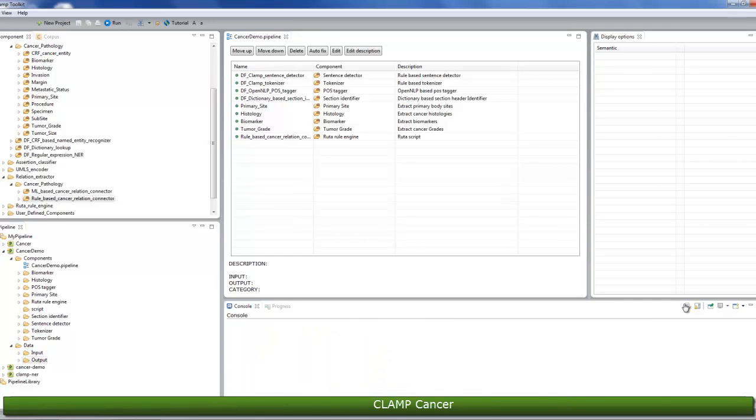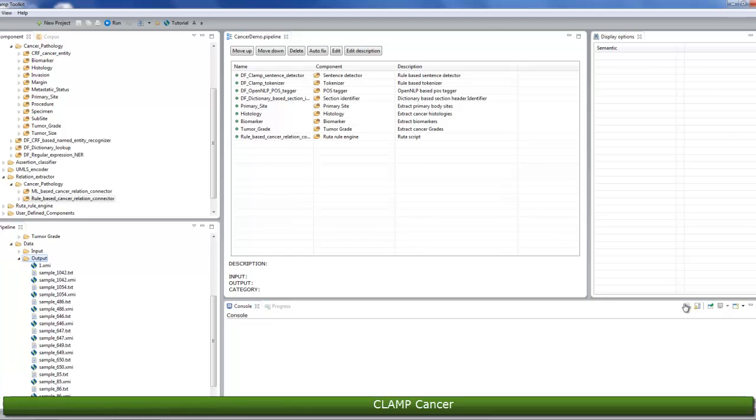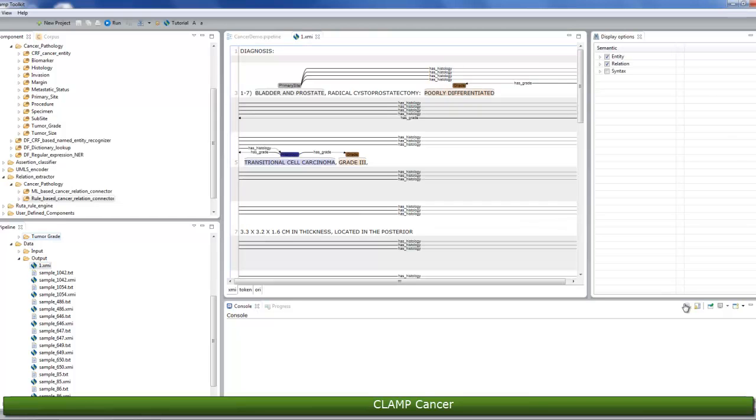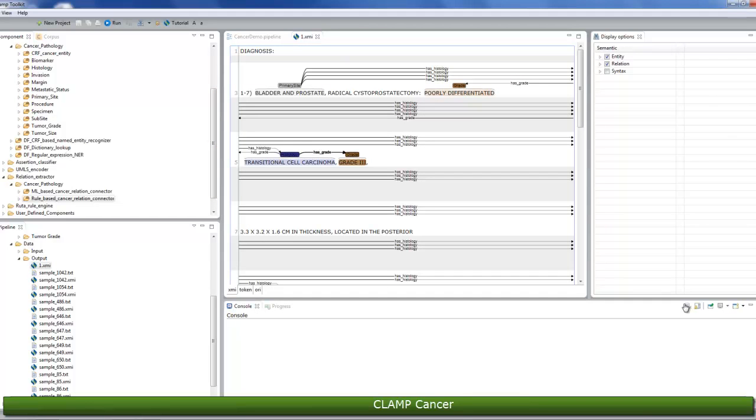Once the process is completed, the generated files are displayed in the output folder. Clicking on a file with the .xmi extension allows you to view its original content annotated with recognized clinical concepts. Different types of clinical concepts will be highlighted with different colors.